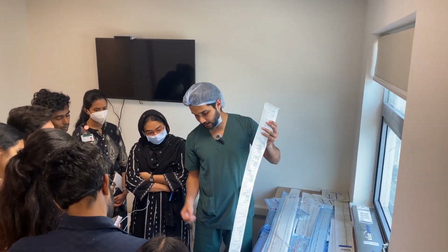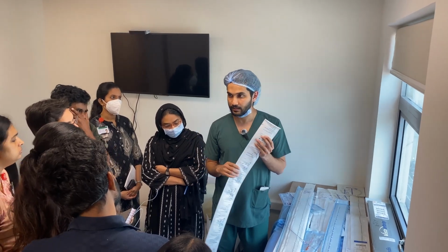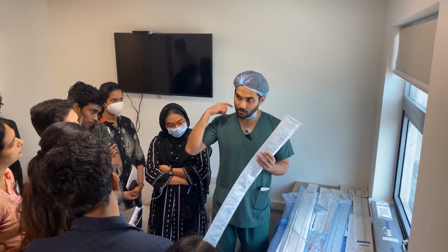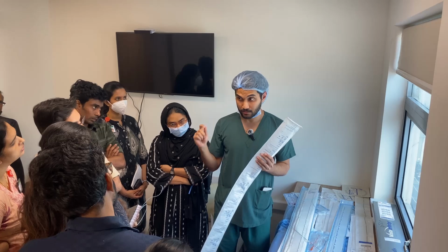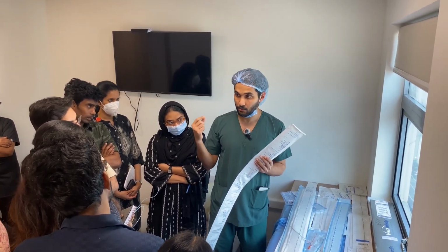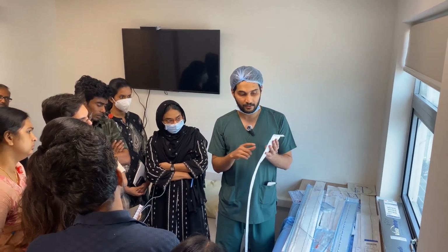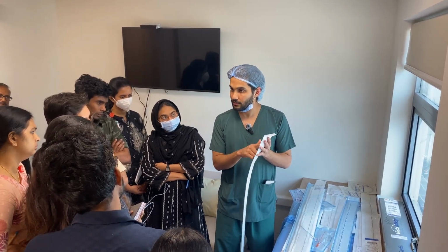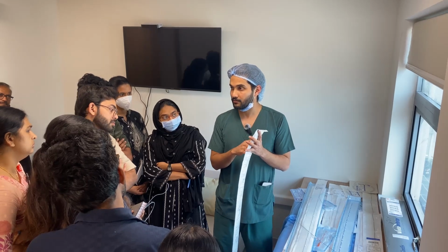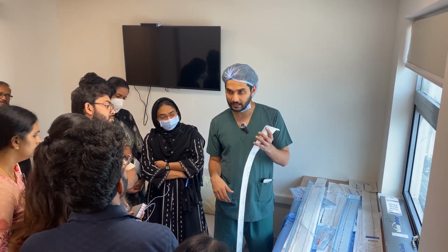നമ്മൾ ഡിസ്റ്റലി ഒരു തലയിലെ ആർട്ടറിയിൽ പോകണം. അപ്പോൾ ICAയെ ക്രോസ് ചെയ്യാൻ വേണ്ടി നമ്മുടെ ഷീത്ത് കൊണ്ട് പറ്റില്ല. നമ്മൾ ലോങ് ഷീത്ത് ഇട്ടാലും അതിന്റെ ഡിസ്റ്റൽ ടിപ്പ് കുറച്ച് സോഫ്റ്റ് ആണ്, പക്ഷെ അതിന്റെ ഡിസ്റ്റലി പോകണമെങ്കിൽ അത് ഡാമേജ് ഉണ്ടാക്കും. പിന്നെ ലൂമനും വലുതാണ്. അപ്പോൾ ഡിസ്റ്റൽ ആക്സസ് കിട്ടാൻ വേണ്ടി നമ്മൾ ഗൈഡ് ചെയ്യും. ഇതിന്റെ അകത്തൂടെ ഒരു മൈക്രോ കത്തീറ്ററോ നമുക്ക് വേണ്ട ഒരു വയറോ പാസ് ചെയ്യാം. മനസ്സിലായി? അതിനാണ് ഗൈഡിങ് കത്തീറ്റർ ഉപയോഗിക്കുന്നത്.